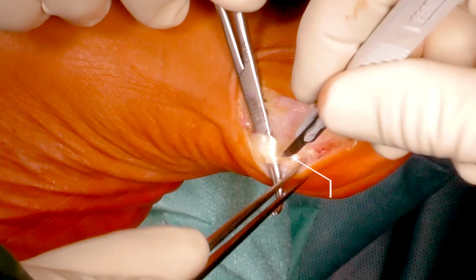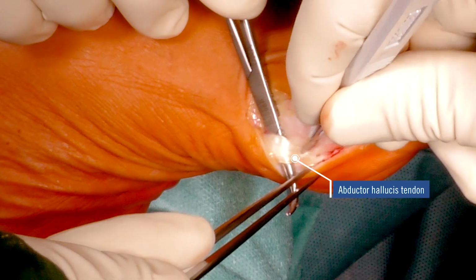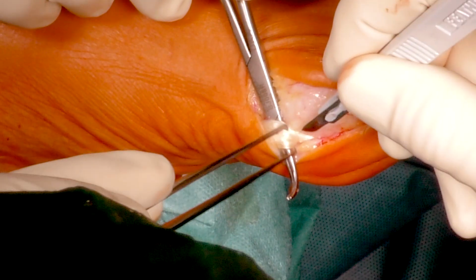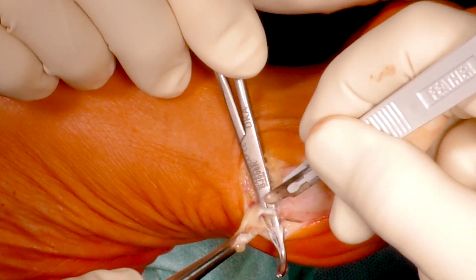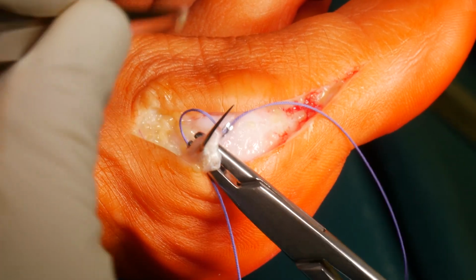Optionally, in the case of a pathologic plantar position, the abductor hallucis tendon is detached from the capsule through a tangential cut and secured with a stitch. Later, the tendon can be anatomically reattached.